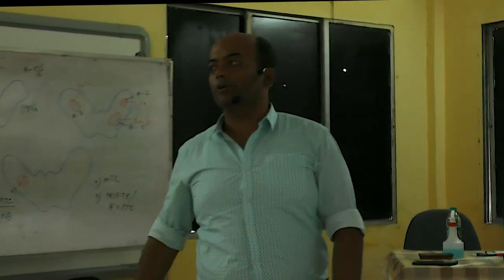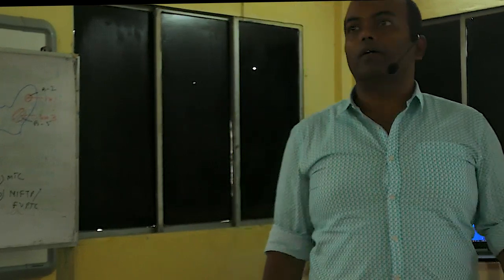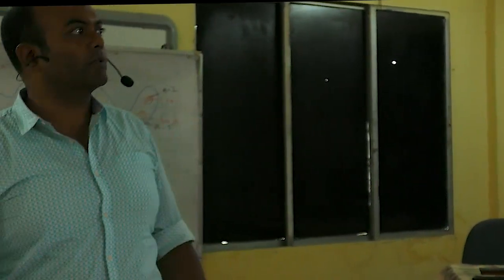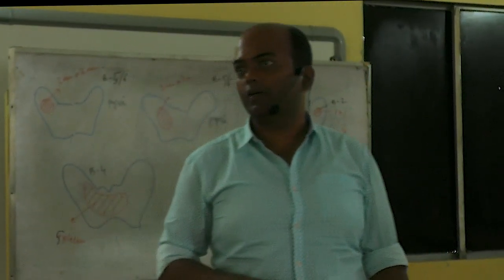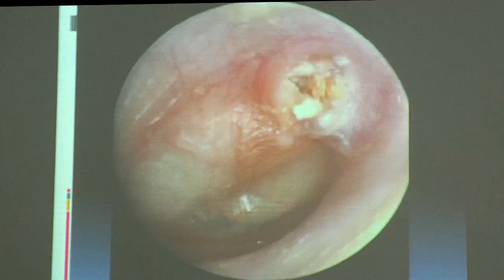We'll move on to the next topic of the day, which is interpretation of CT scan of the temporal bone. I had a few slides on the initial physics and all those things, but we'll skip these because I saw that most of this has been covered by Amitabh sir. So we'll just go on.